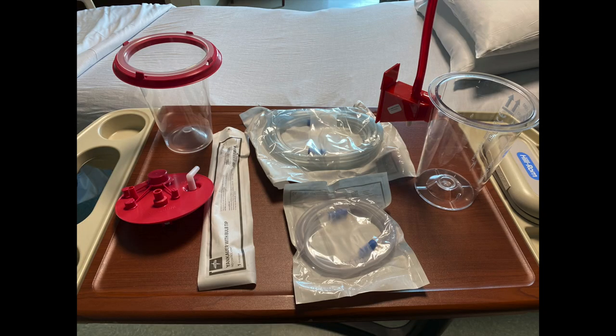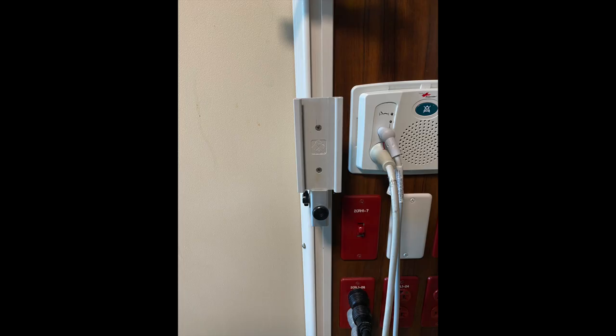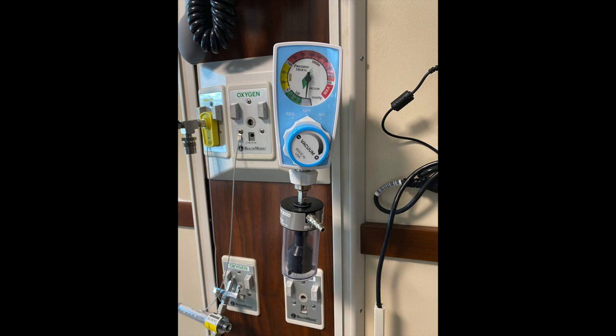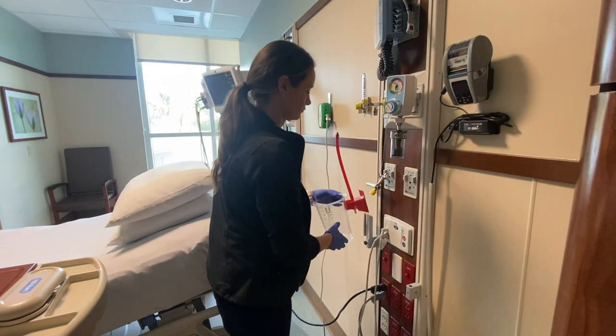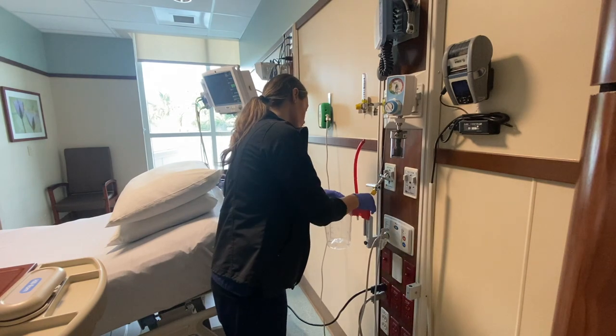Next, we're going to set up suction. These are the materials at my facility that we need to set up suction: an outer suction container, an inner suction container with the lid, a long suction tubing, a short suction tubing, and a yanker. We also need a suction canister holder and a wall vacuum device. First thing I'm going to do is take the outer container and connect it to the wall suction holder. Make sure it's stable.